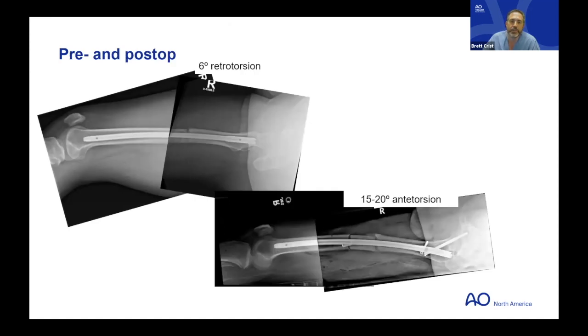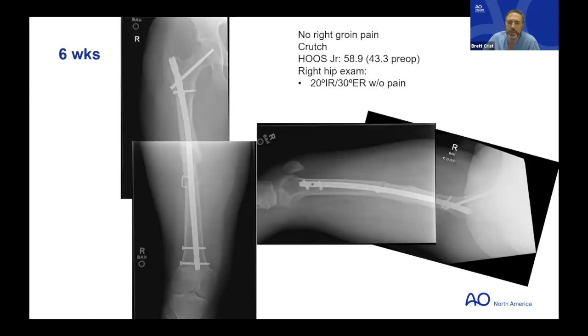And so preoperatively 6 degrees of retrotorsion. Postoperatively, again, it's hard for the x-ray tech to get that perfect lateral of the knee distally. But there, it was closer than it was, and I thought that we did actually do what we saw fluoroscopically.